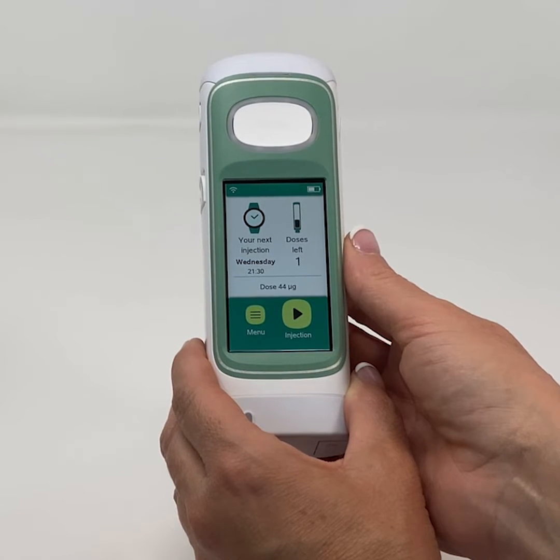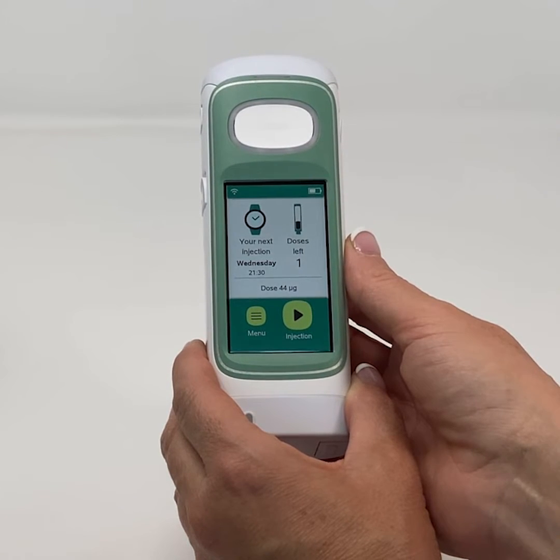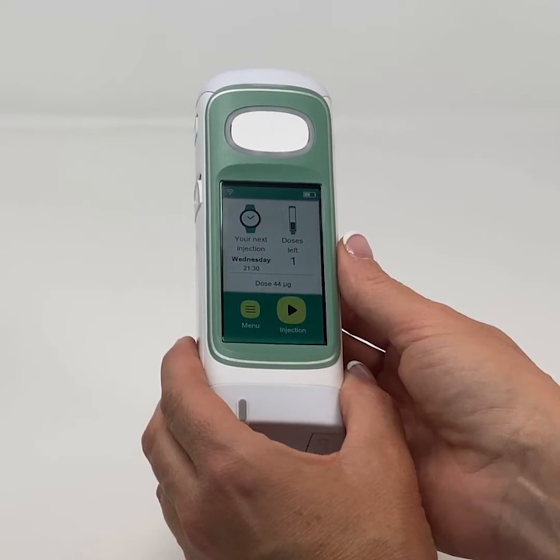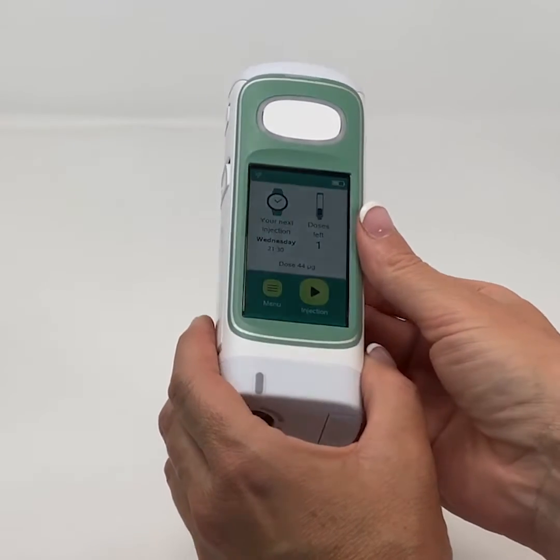General precautions are available in an instructions for use booklet that comes with the device and should be read prior to use. This is an electromechanical device that automatically injects a preset dose of medication through single-use needles, which insert and retract with each injection.